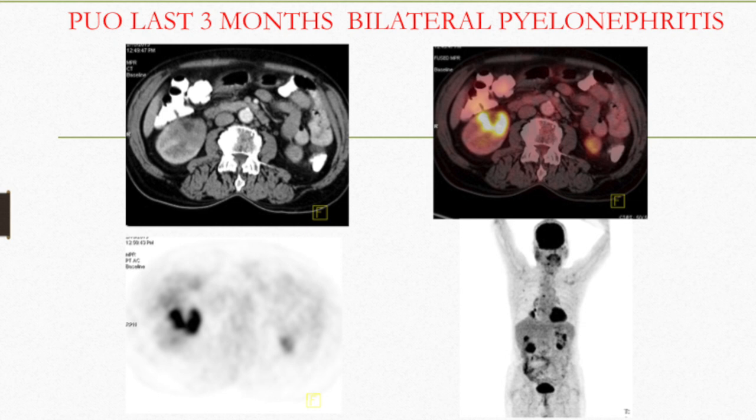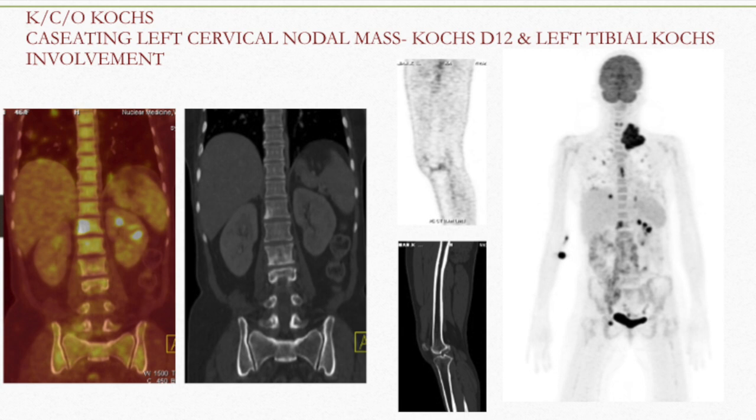In the lower pole of the left kidney there is also a focal area of uptake, making it a case of bilateral pyelonephritis. This was a known case of tuberculosis showing a caseating left cervical nodal mass. The patient also had knee pain and back pain, so PET was done which showed D12 vertebral body with patchy sclerosis, a subtle soft tissue component, and minimal uptake in the knee joint secondary to synovial thickening — confirming cervical nodal tuberculosis with D12 vertebral and knee joint involvement.